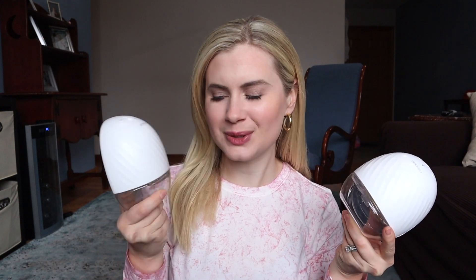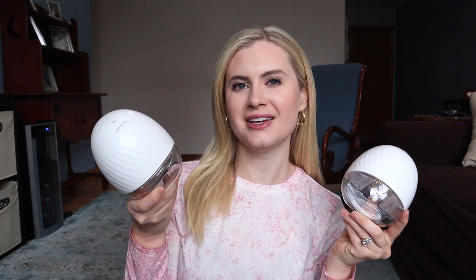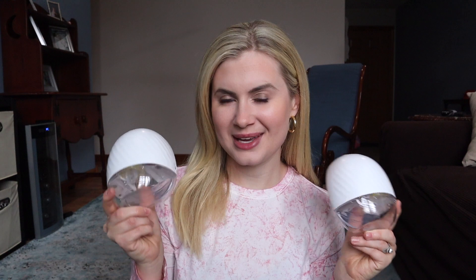Hey guys, today we're talking about the Horigen Wearable Breast Pumps. You may have seen these on Amazon. I know they're all over the mom groups because they're very affordable, but they also look just like the LV. I was super curious to try them and guess what? They worked great. I liked them.